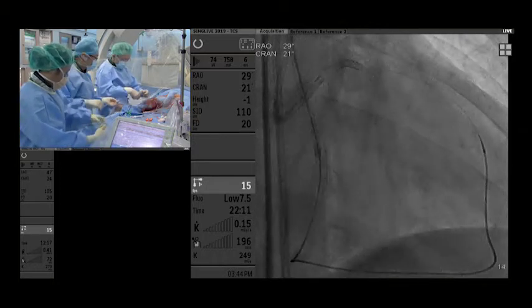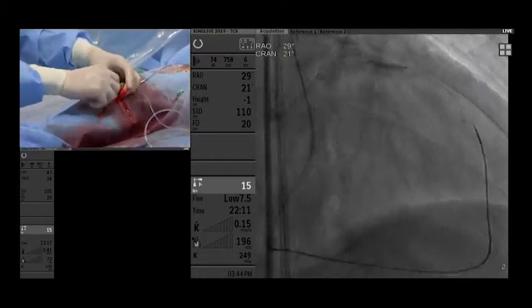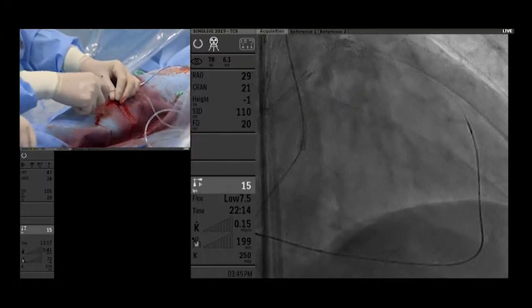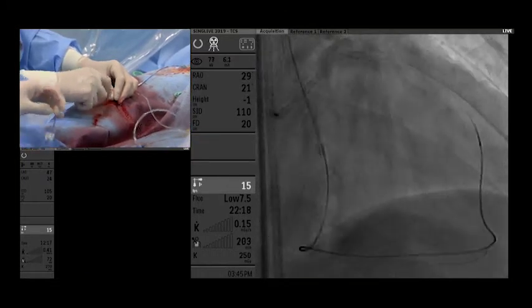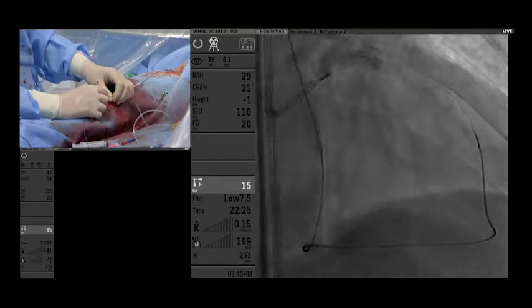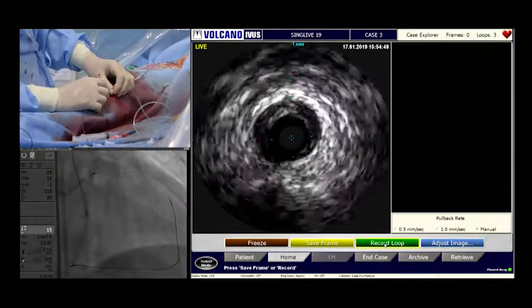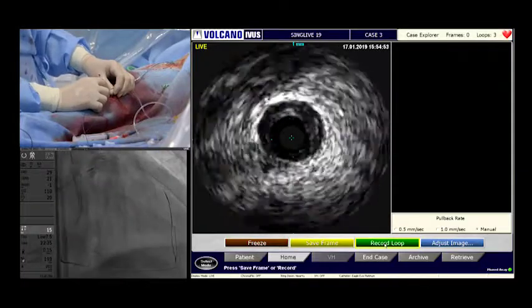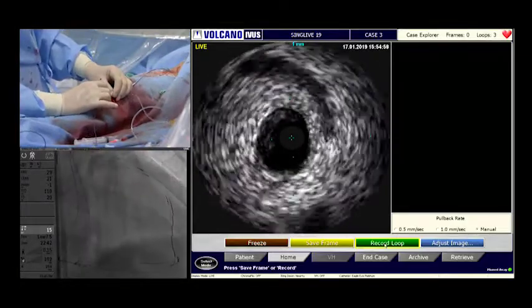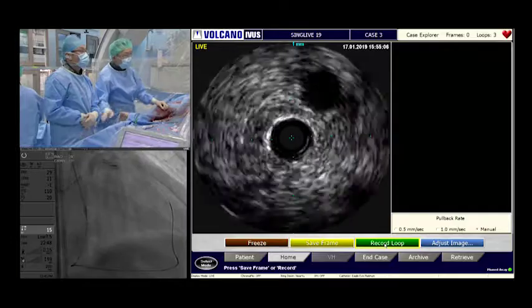Actually, the wire which made the connection is Gaia Next 2, but its penetration force was too strong to negotiate with the proximal plug. So all procedures were suggested by IVUS findings. The IVUS is very helpful. Very helpful. Okay, ring down again. Show the IVUS, please. Ring down. Okay, so we enter the proximal LAD, and I put the stent from here, and it's 1, 2, 3. And maybe this part will be, I think, around the landing zone. Okay, recording.